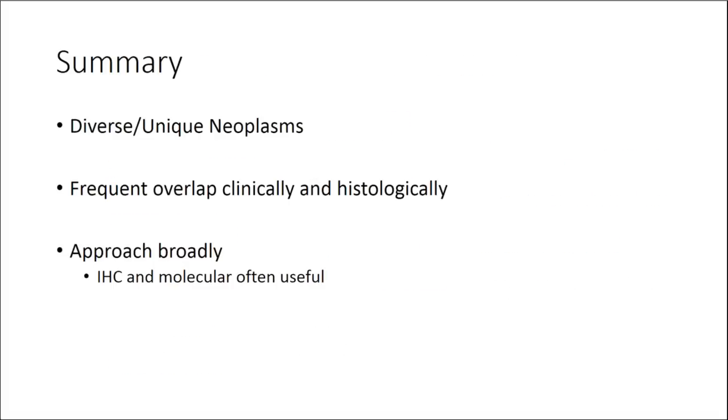Just to summarize, the sinonasal tract has very diverse, unique neoplasms, and interestingly, a lot of overlap, both clinically and histologically. Our approach is to do very broad immunohistochemistry as well as molecular profiling so that you can accurately classify these lesions.